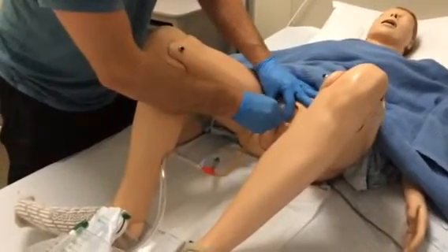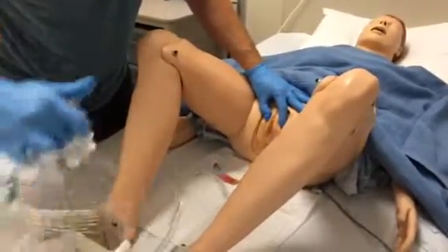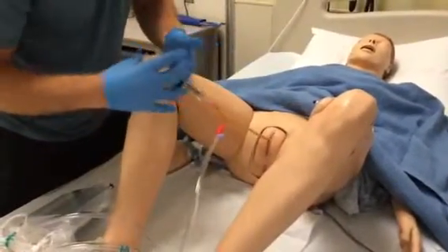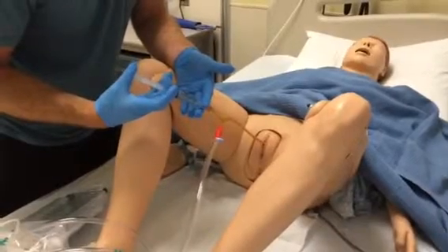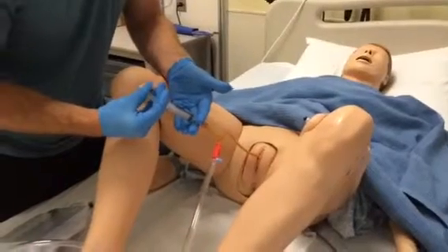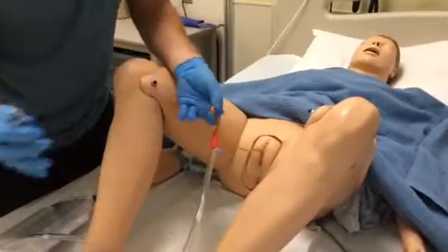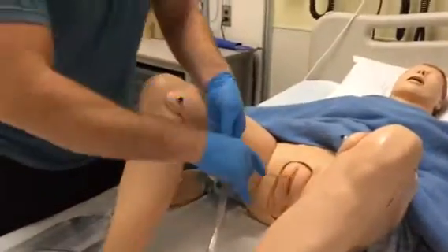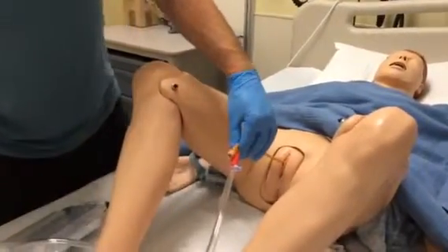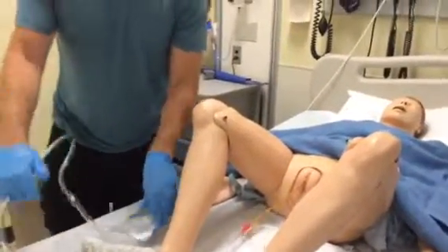And I'm going to go until I see a little bit of urine leak to this box here. And so at that point, I would go ahead and fill the Foley with 10 milliliters of water. And remove that. And then I would go ahead and check just to make sure it's in. And we are in.